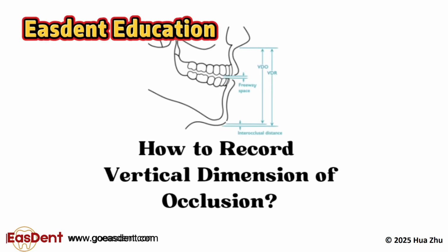To understand more about VDO and VDR, you can watch the video How to Record Vertical Dimension of Occlusion.